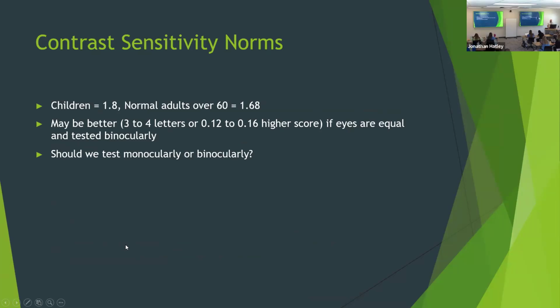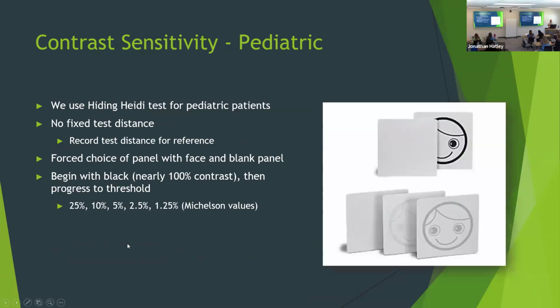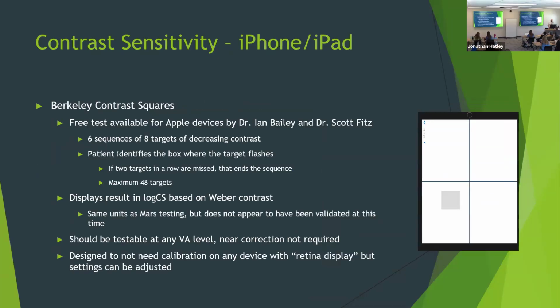Make sure that you know those ranges. We can catch up on some of this next Monday because there are 2 other contrast sensitivity charts that we use in clinic. But make sure that you understand how to do the Mars and how to do the Colenbrander contrast side of that chart.